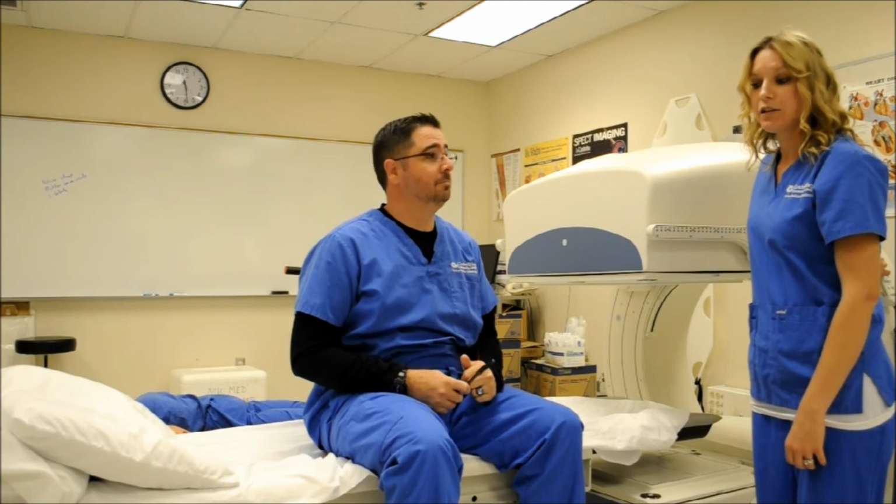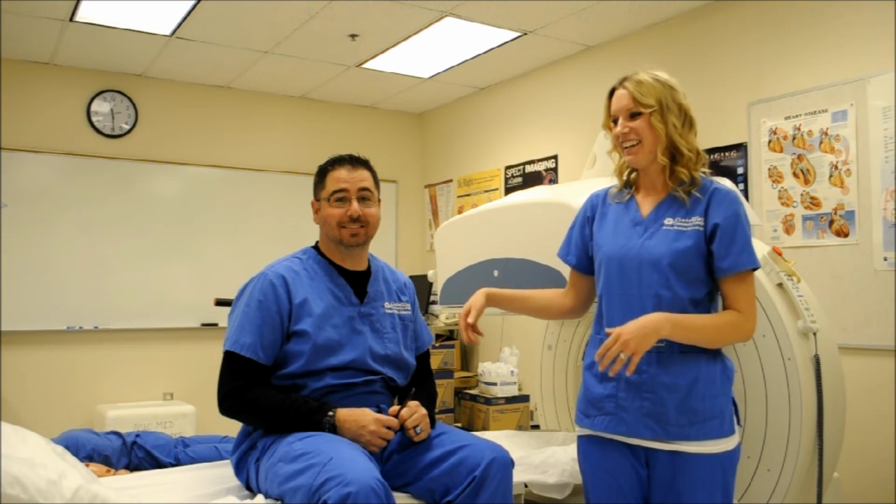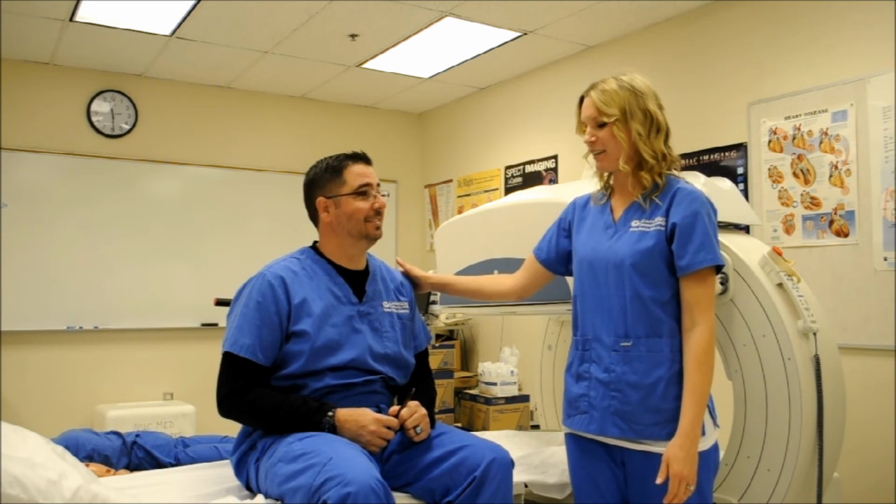So what we need to make sure of is when we do the delayed pictures is that all the pictures match up. The pictures of the flow portion of the soft tissue and of the delay, the bone pictures. So we want matching pictures each time. All right, Rusty, you're free to go. Thank you.